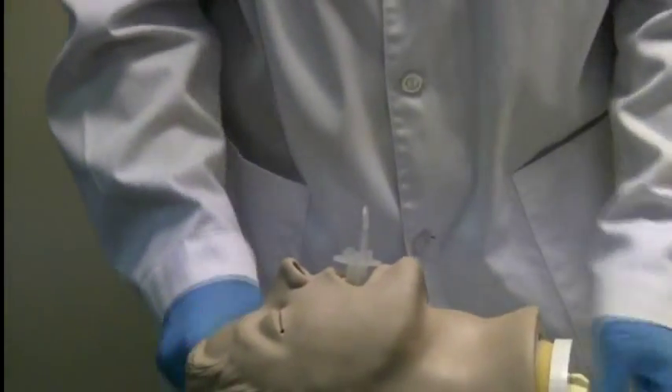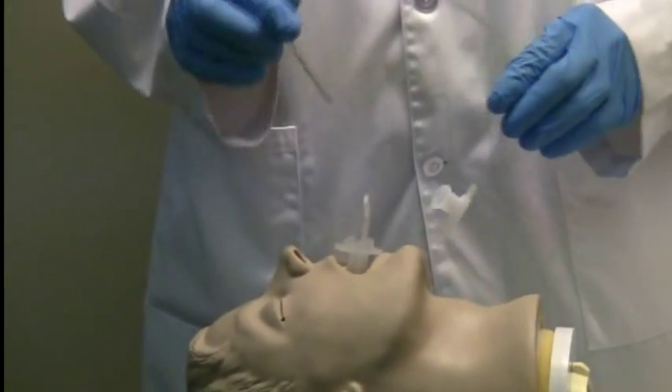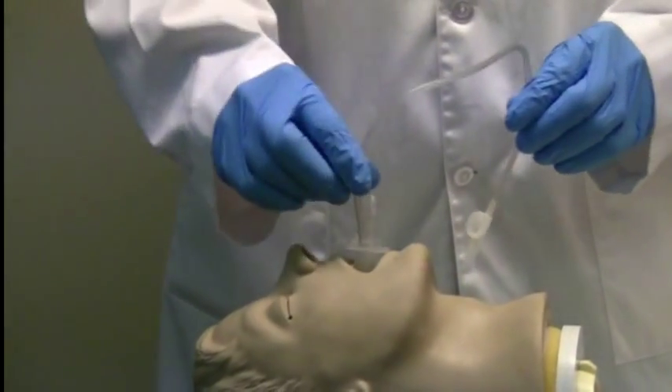In cases where a 14 French catheter is desired, this is easily applied.